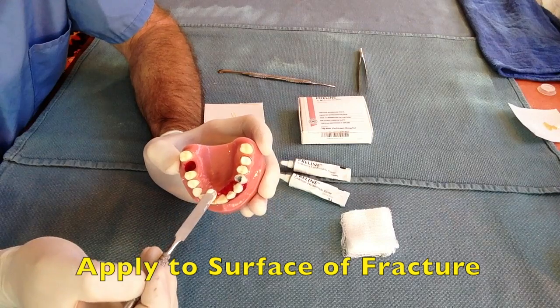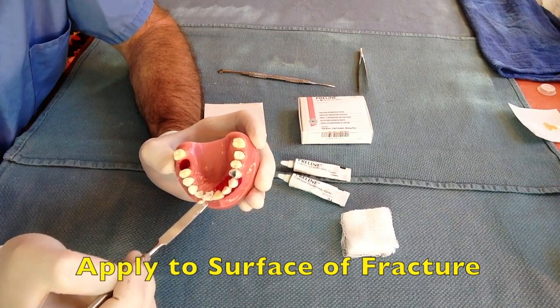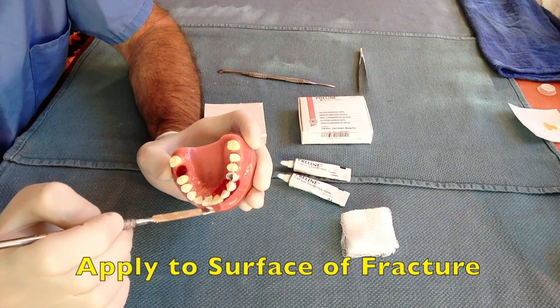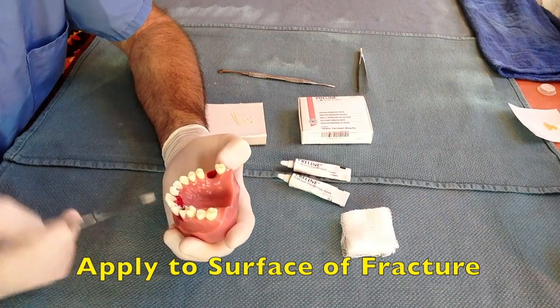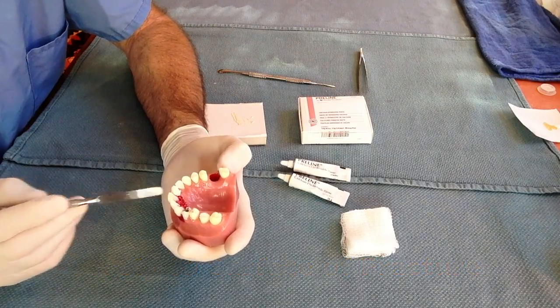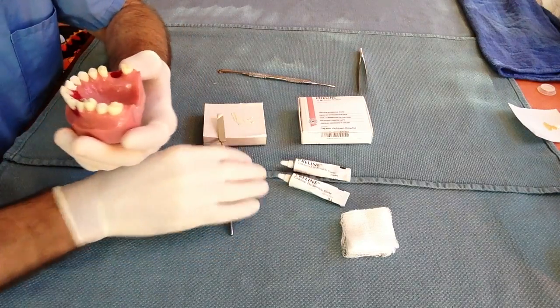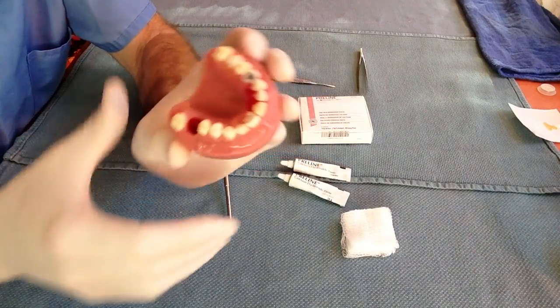Remember, the tooth must be dry in order for the calcium hydroxide to adhere properly. The moist environment in the mouth will speed up the hardening process of the calcium hydroxide. Have the patient keep their mouth open for 10 or 15 minutes after applying the paste to the tooth. A rolled up gauze roll positioned away from the site of the covered tooth will help the patient keep their mouth open.